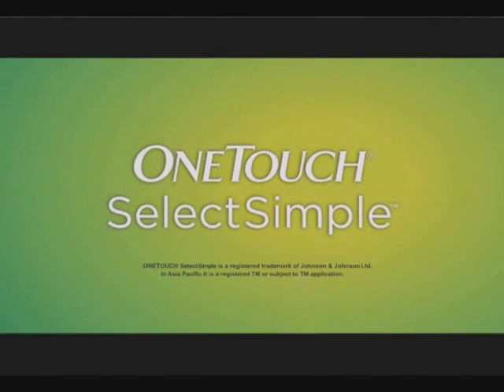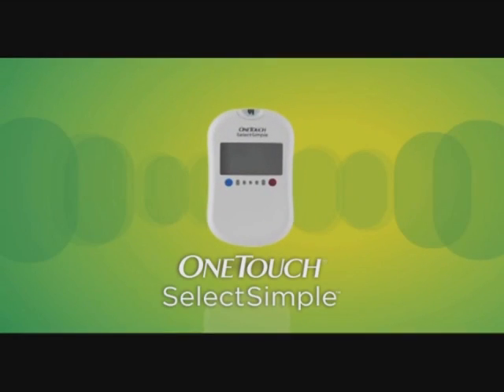Meet the new OneTouch Select Simple, a self-monitoring blood glucose meter that helps you better understand your readings.